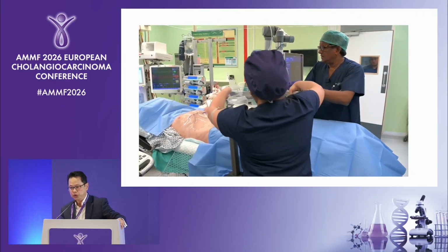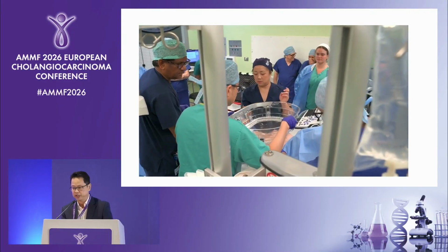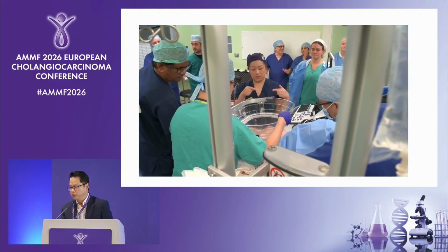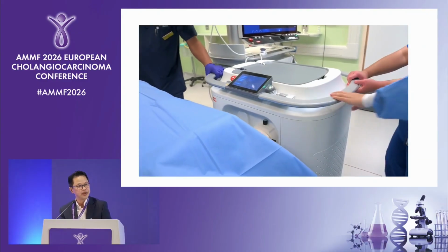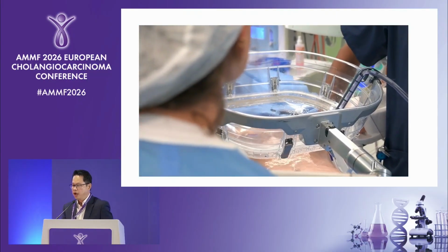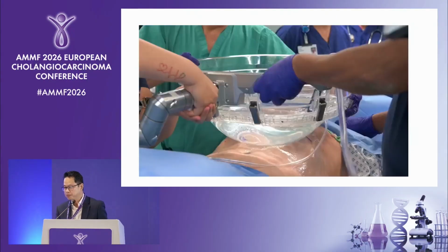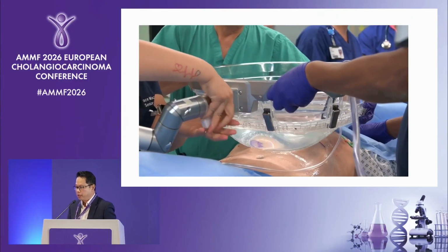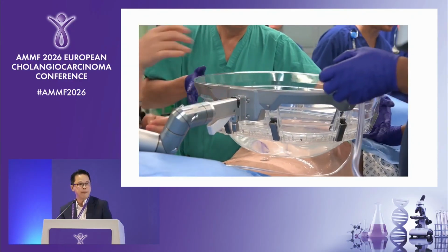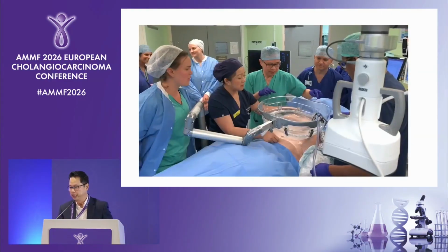And then we bring this close to the patient on top of the liver, obviously. And you position that accordingly, and you bring in this system here that degasses the water, and you deliver the water into this water bath. We have to manage that appropriately to avoid overloading it, obviously.